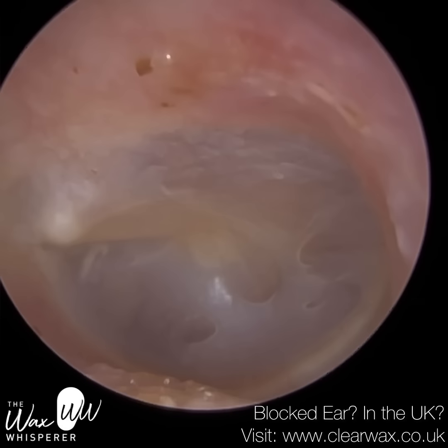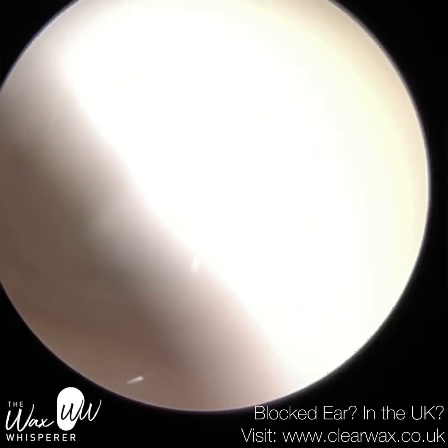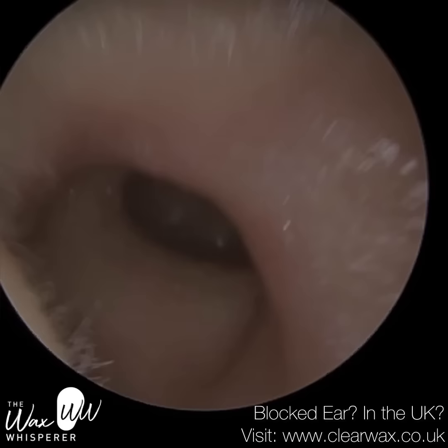I managed to get that plug of wax — it was quite embedded. The eardrum has got some thinning on it, so there are different sections that look thinner than others and it can give you these shadow effects. I hope you enjoyed that video, guys. Take care, keep well, and speak soon. Bye.